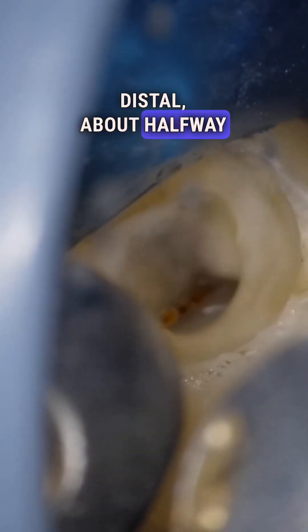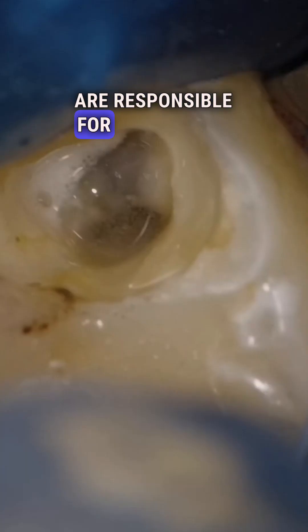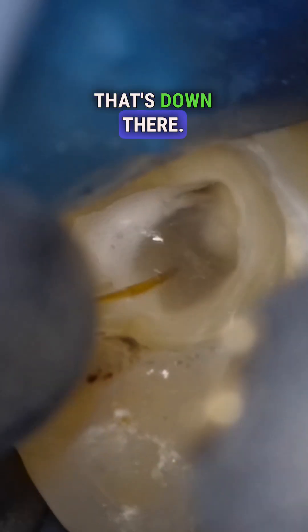So again, down in the distal, about halfway down, you can see when I activate there's quite a bit of power. And these microcavitation bubbles are responsible for essentially cleaning the inside of the canal space, the dental tubules, and all the intricate anatomy that's down there.